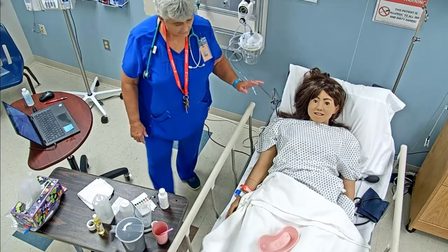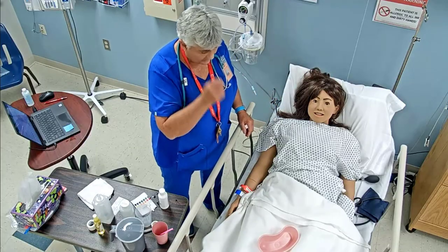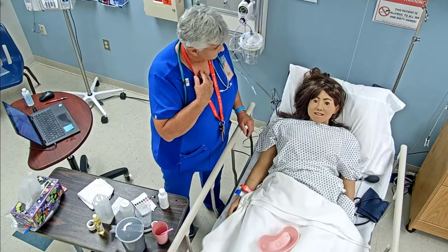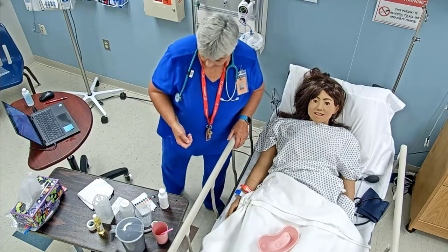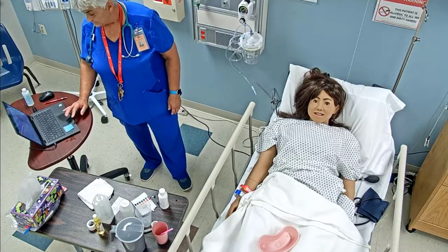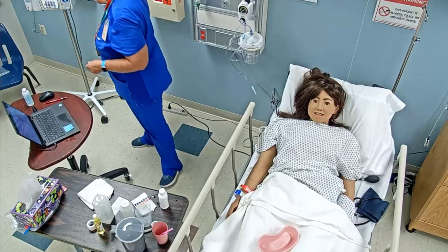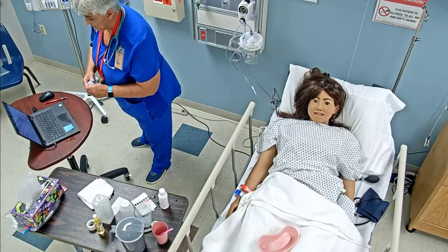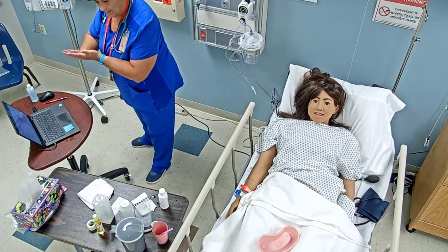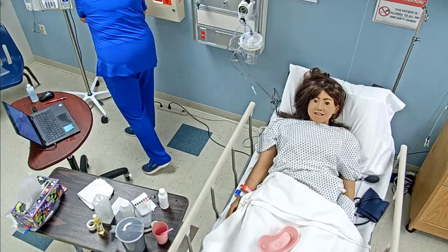And then also we're going to make sure that you're not having any nosebleeds, because when you have that tube in there, your nose kind of gets a little dry, even in the back of your throat. So we want to make sure we're not having any bleeding or anything like that. So once I've got that all documented, then we're just going to put some clean gloves on, and I'm going to clean up your area.